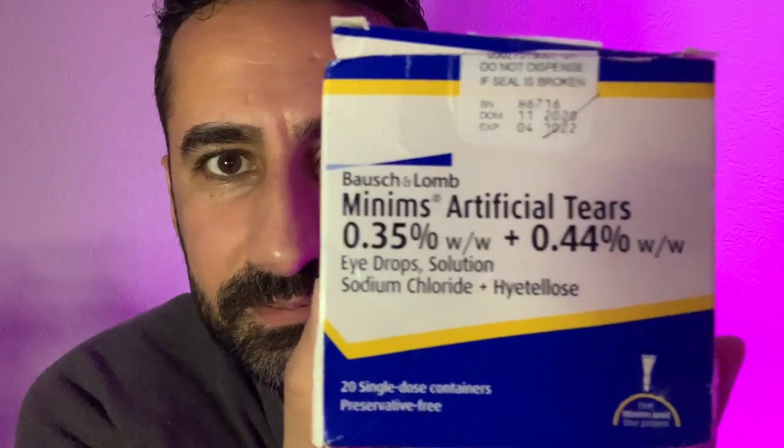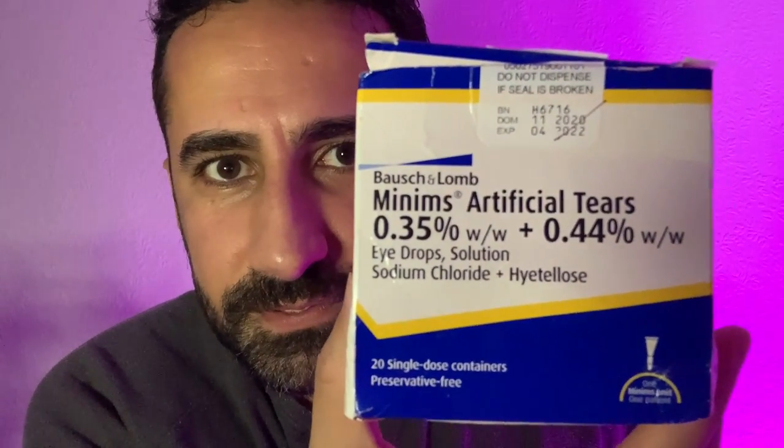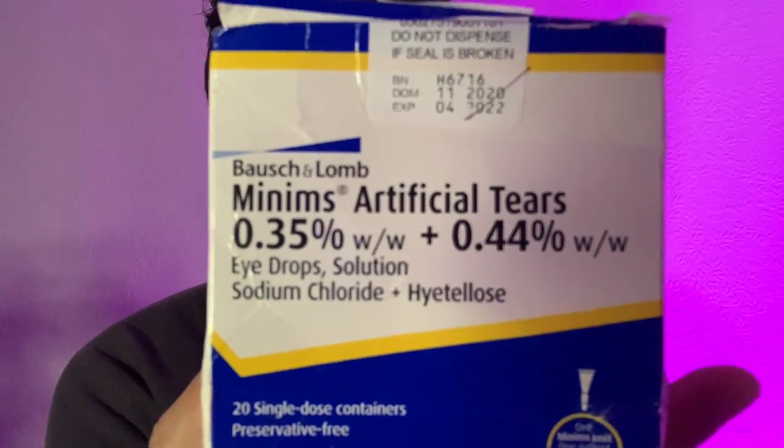Now, what if your patient has a little bit of dry eye syndrome? They may be experiencing some soreness, grittiness, redness, or general ocular discomfort. You may want to recommend or instill a drop of lubricant into the eye at their clinic appointment just to see if it provides some relief. This is your minims artificial tears — the active ingredients are sodium chloride and hypromellose.